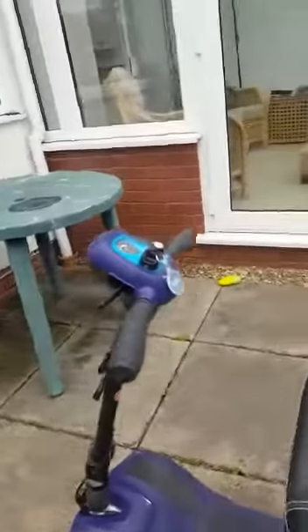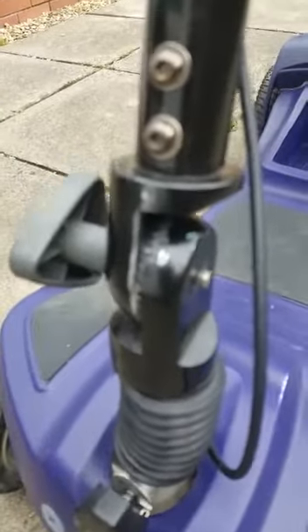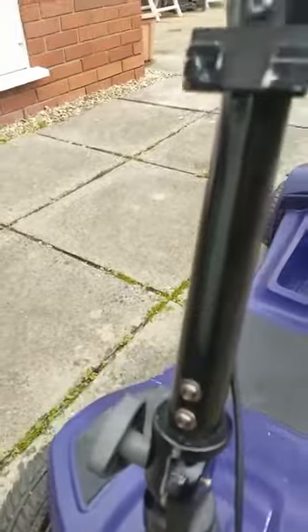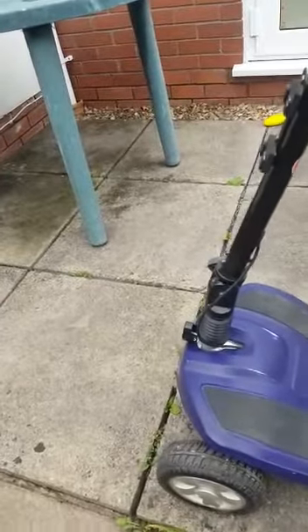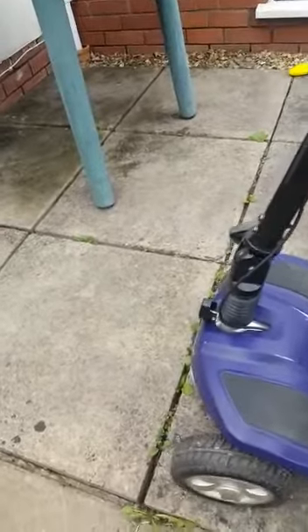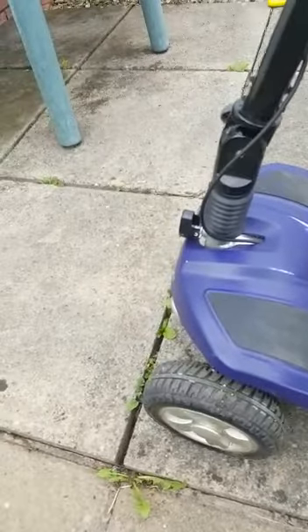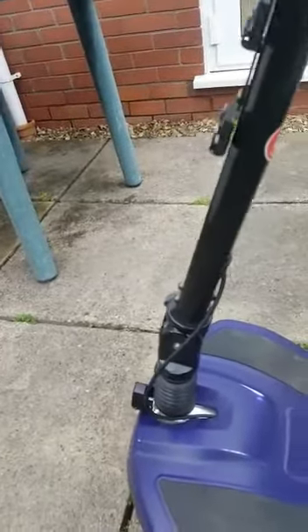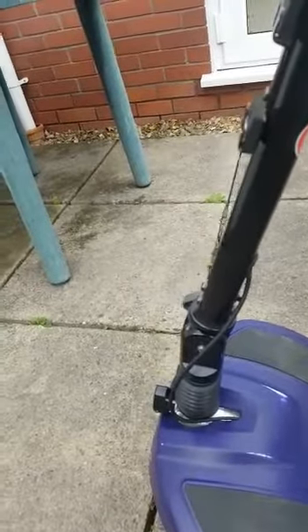Onto some of the other features of this machine. There's a scuff mark here as well, just from taking the basket off, and that scuff mark there is purely from the tiller drop mechanism. Just by checking it, it squeaks and rattles, and it rattles as it goes along.